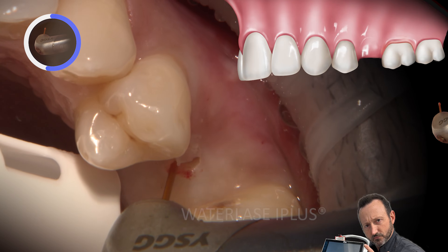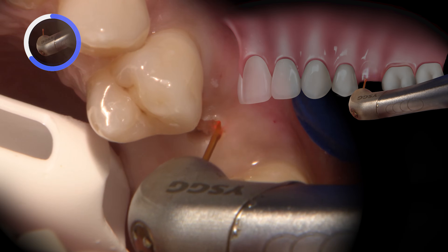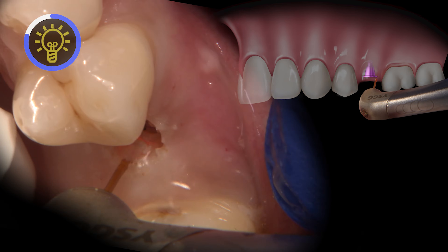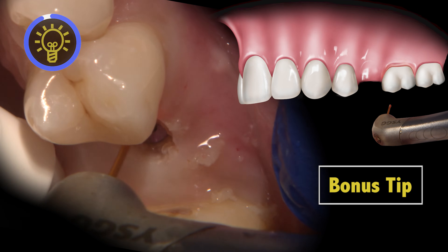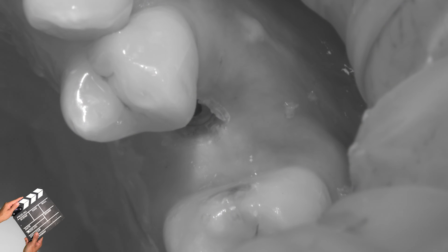In areas where there is ample keratinized tissue, like in this situation, I use the laser to remove the tissue covering the implant instead of displacing it to the sides. The radiation wavelength of this laser allows for great soft tissue coagulation without burning the soft tissue. There are also settings which allow for bone recontouring if bone has grown over the cover screw.